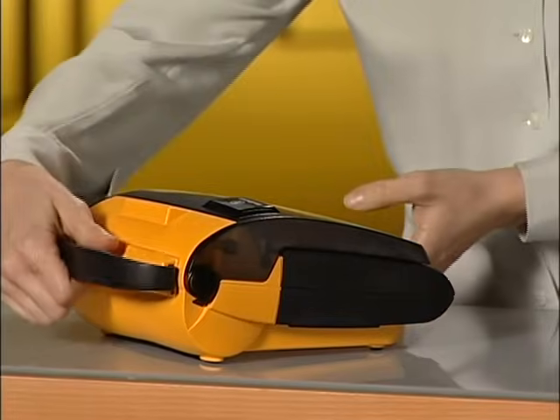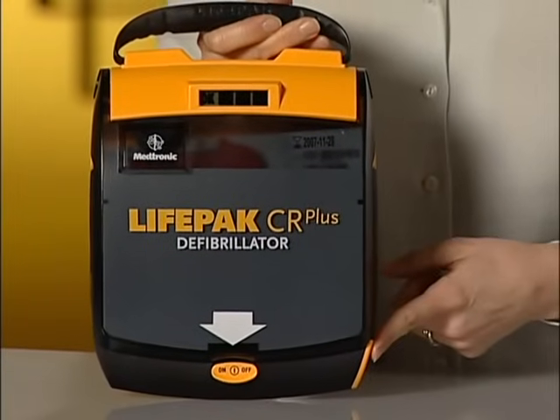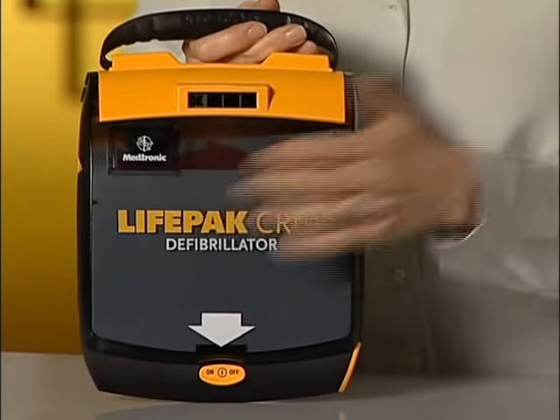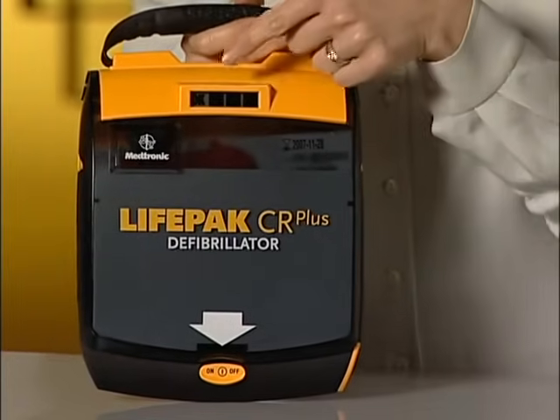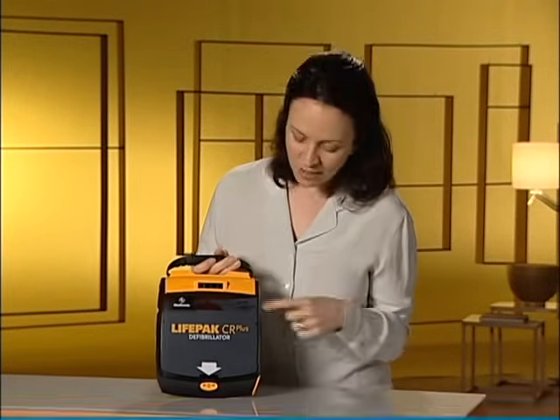The first time you unpack the LifePak AED, you should inspect it briefly to verify that it responds appropriately and wasn't damaged in shipment. The LifePak AED comes with the battery charge pack already charged and in place. The electrode pads are also already in place inside the lid. It's ready to use. You can tell by this OK sign right here. Check the OK sign. Check the use-by date on the electrode package. You can see it through this window.